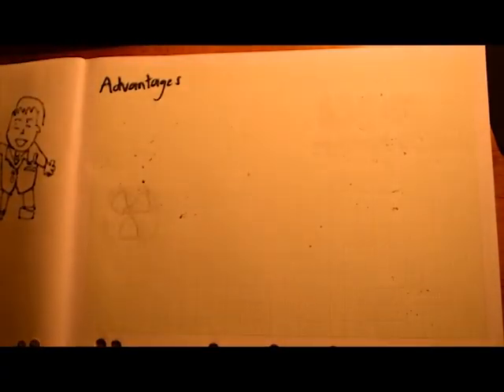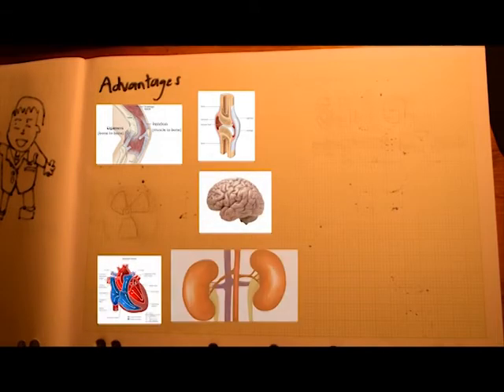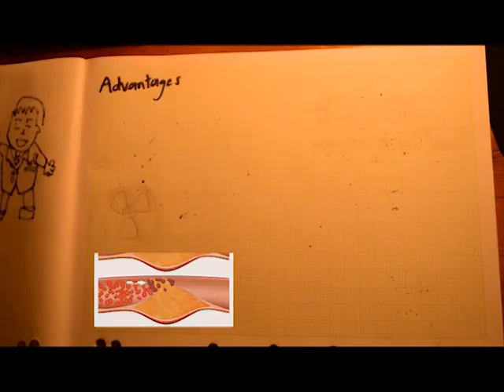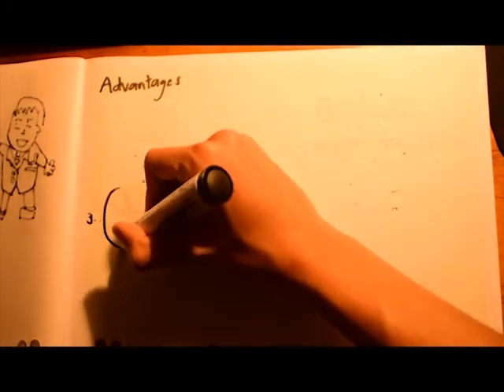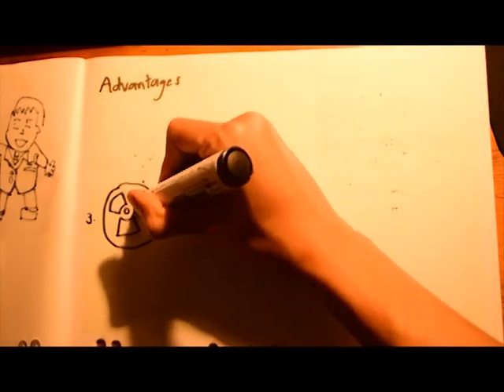Advantages of the MRI. MRI is useful for showing soft tissue structure, for example ligament and cartilage, and organs such as the brain, heart, and kidney. MRI also can provide information about the blood circulation through certain organs and blood vessels, allowing identification of problems with blood circulation such as blockages. MRI does not use the ionizing technique, that means no radiation, painless, and safe for the patient.